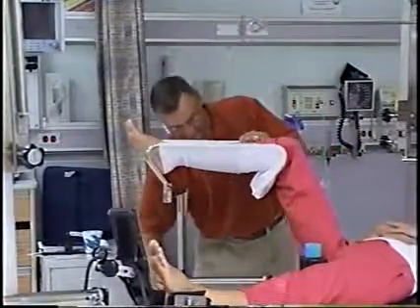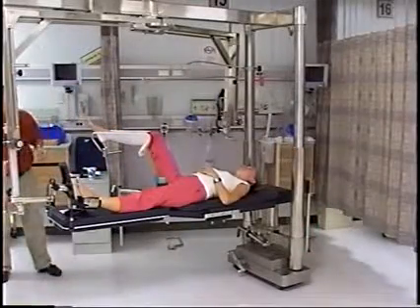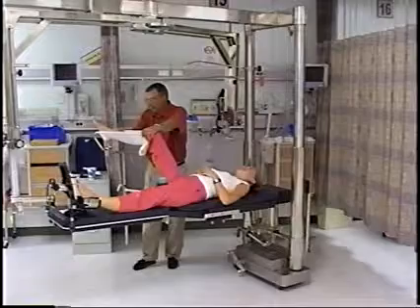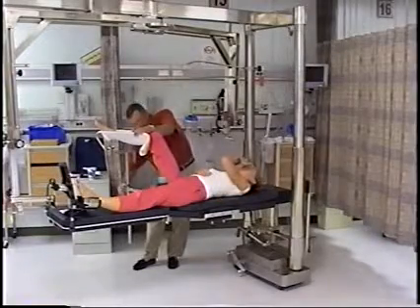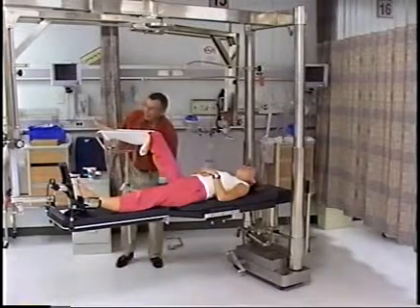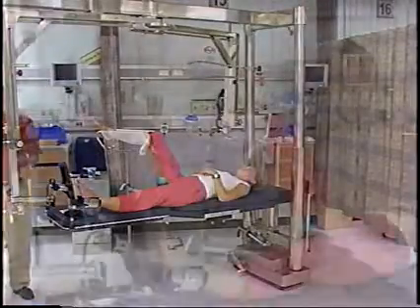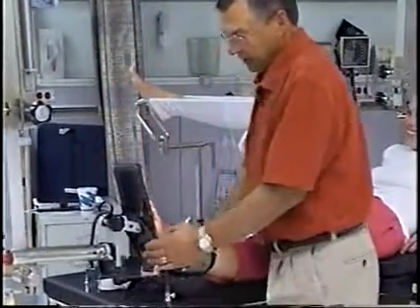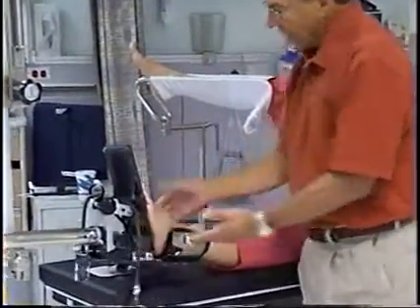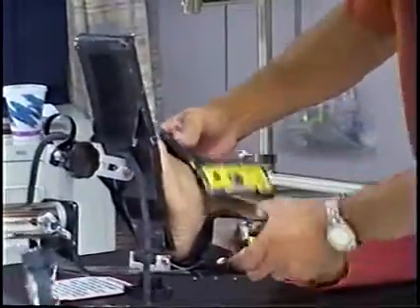All right. Okay, once we've got her well leg in, now remember, she's going to be already intubated and asleep, so the doc is probably going to abduct this as far away as possible. Once he's got it where he wants it, everything gets tightened down. Remember, in orthopedics, anything you loosen, you retighten. So once she's up there, then we're going to attach the traction cuff. The traction cuff would be padded, maybe some Curlex in there, and that would go in there.